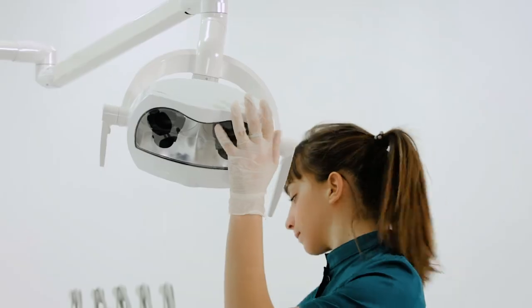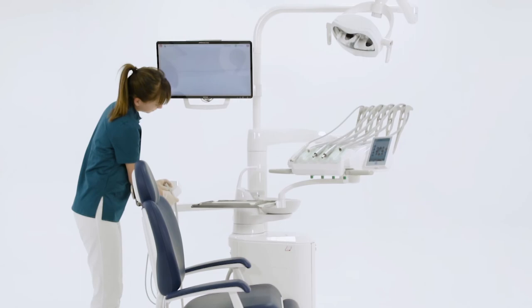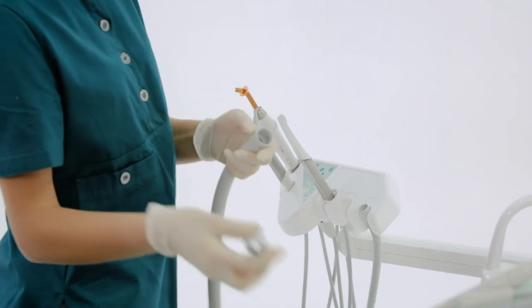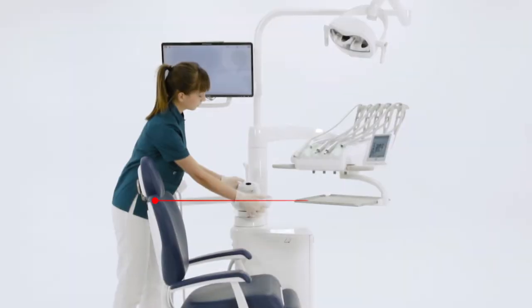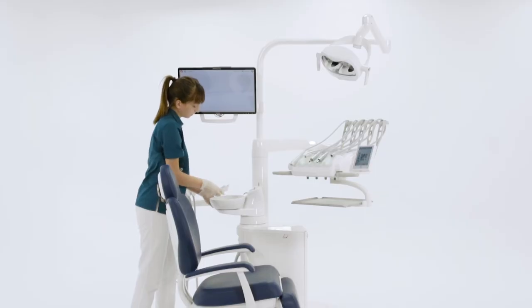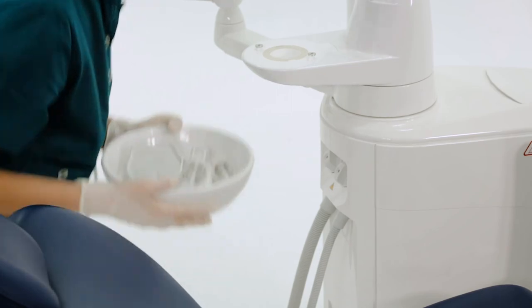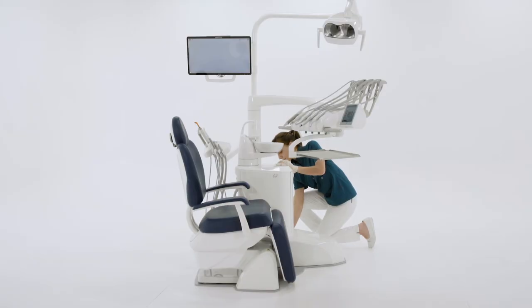Finally, the assistant removes all removable and autoclavable parts of the dental unit to take them to the sterilization area. The last thing to do is switch off the dental unit.